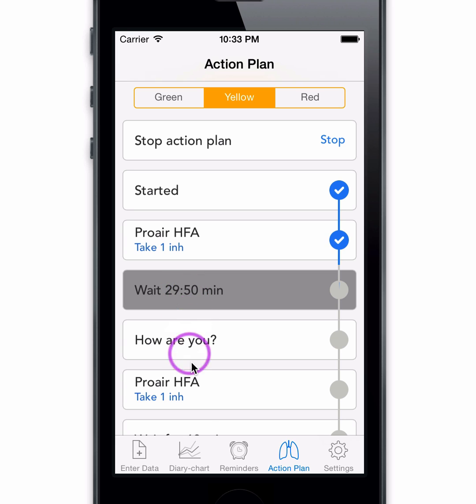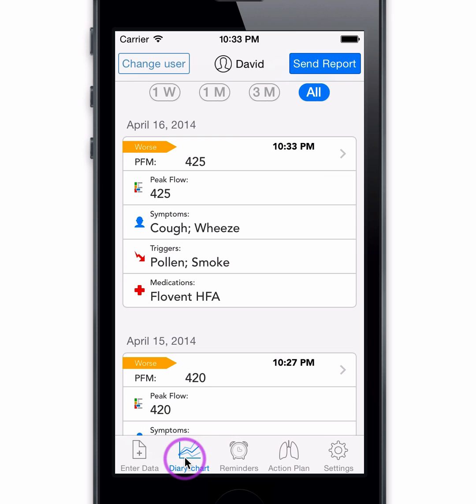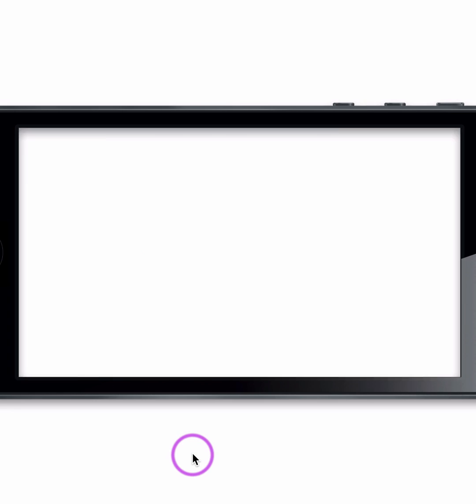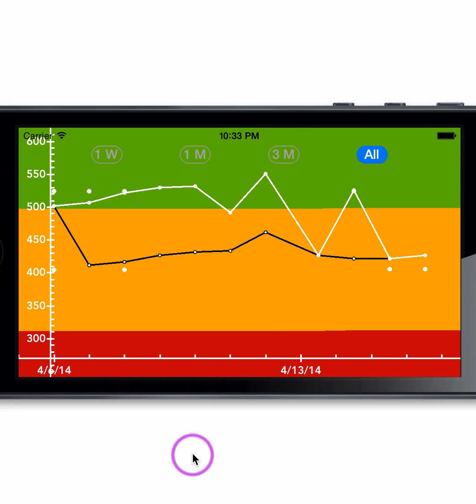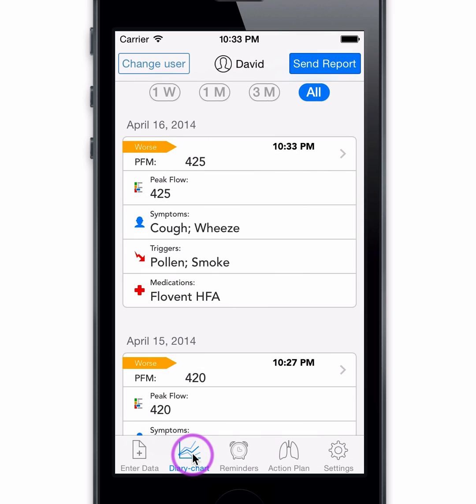You can see your diary by tapping on the diary button. This page is also dual mode. Flip to horizontal position to see the graph of your peak flow measurement values, then flip back to navigate out.